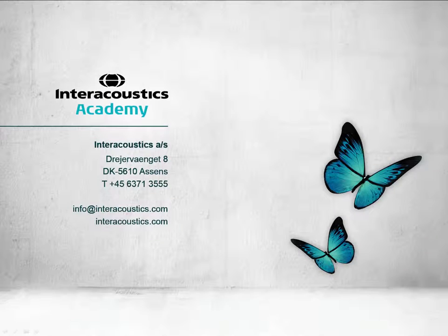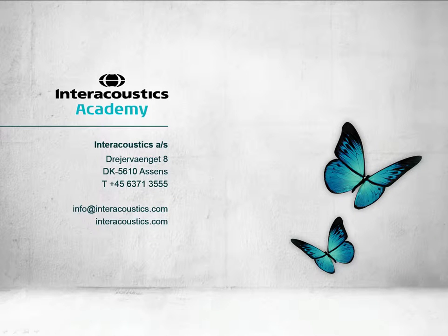This concludes this quick guide video on how to record and analyse the eABR.